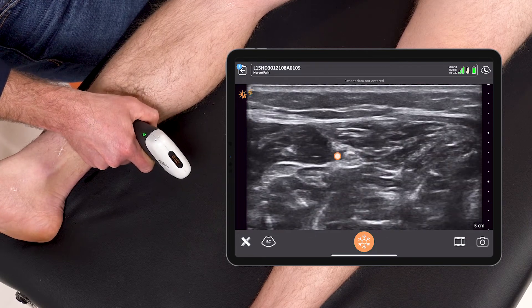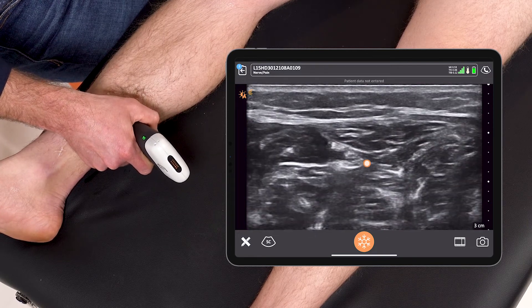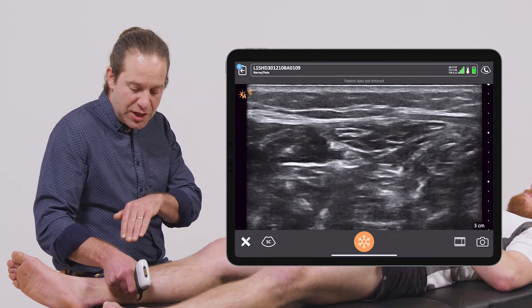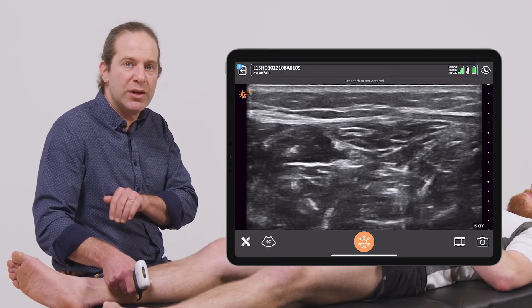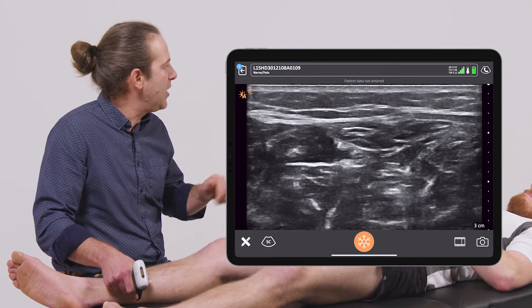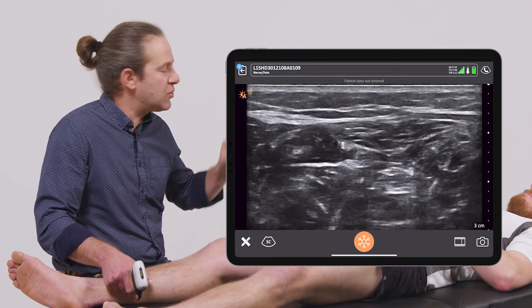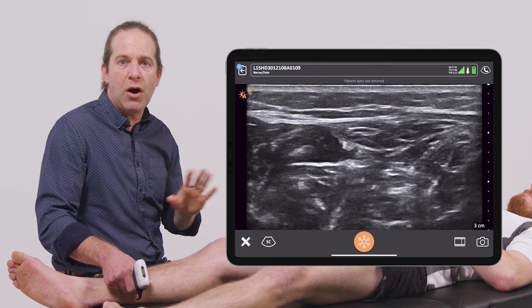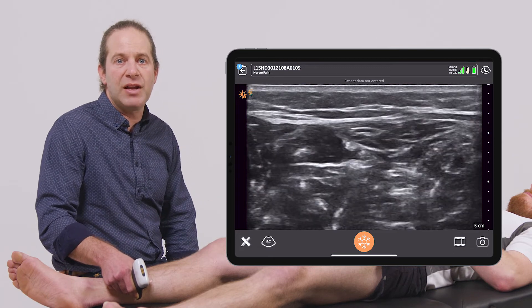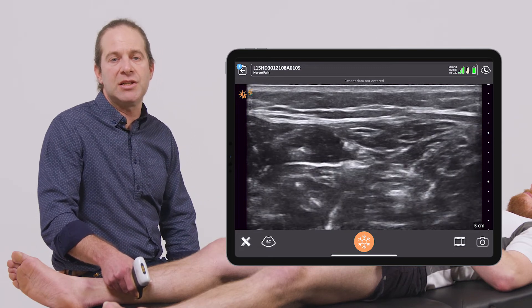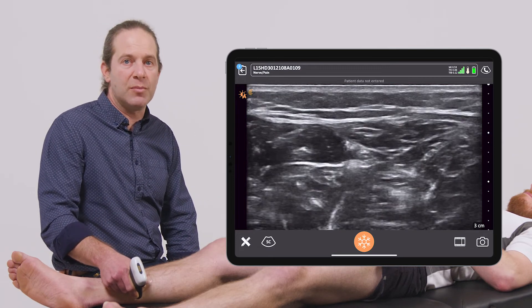Where the artery has diverged and I have a safe trajectory where I can watch my needle come in in real time and then inject just around the nerve, avoiding all the surrounding structures, and provide effective analgesia to the sole of the foot for my patient.